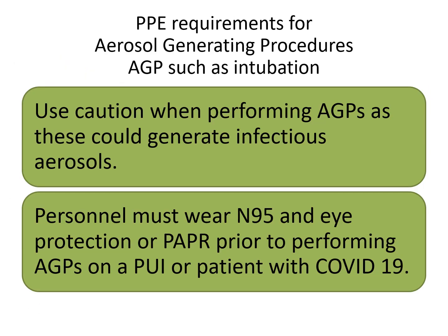Let's first review your PPE requirements. Any aerosol generating procedure, which would include intubation, is included in this, especially with all staff in the room of a patient that is undergoing investigation or confirmed COVID-19. They must follow these PPE guidelines: they must wear an N95 and eye protection or a PAPR prior to performing any aerosol generating procedure.